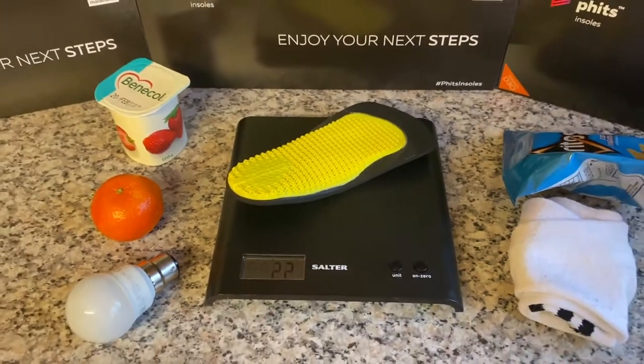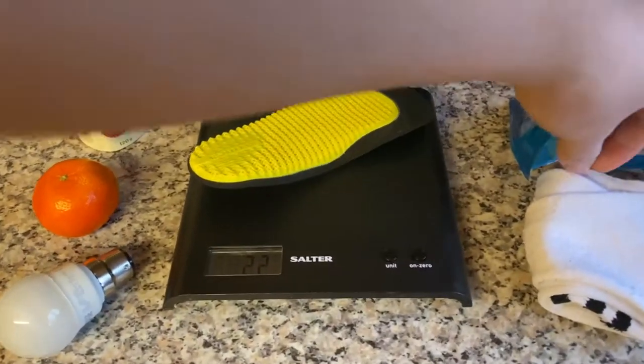Heavy, bulky orthotics are a thing of the past. If you're concerned about the weight of your orthotics, don't worry — FITS are lighter than a sock.